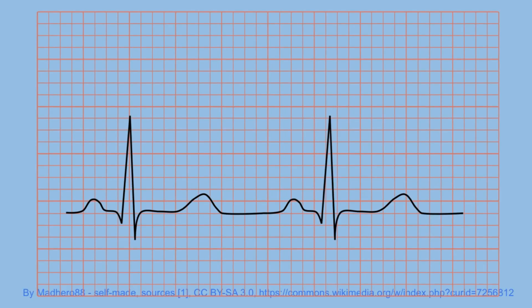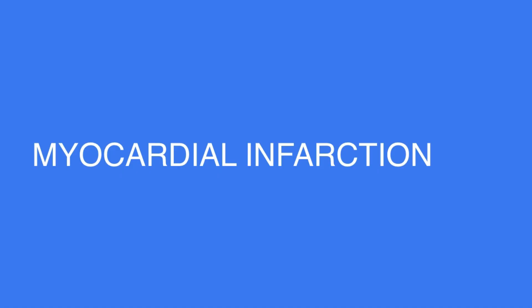For example, this rhythm strip is showing P waves preceded by — and succeeded by — QRS complexes, and all QRS complexes are also preceded by P waves. So this is sinus rhythm. The rate: counting the squares, it would be approximately 75 per minute. That's all that we can tell from this small strip.